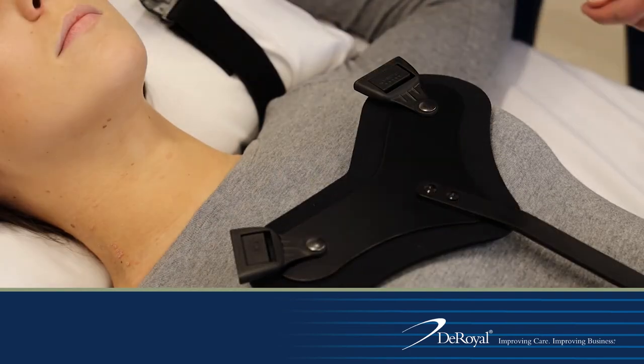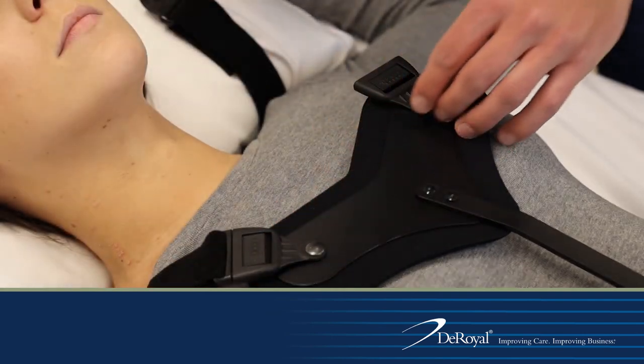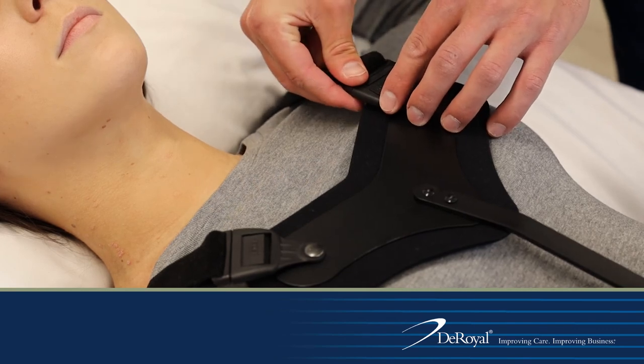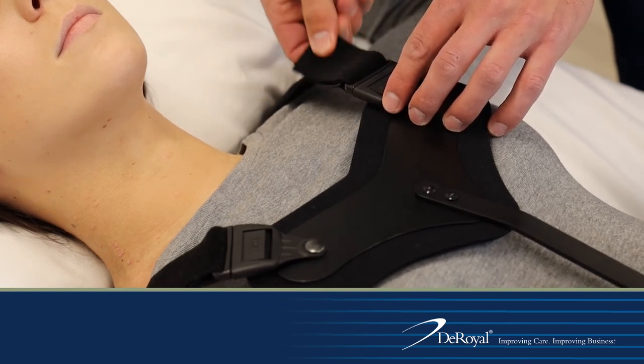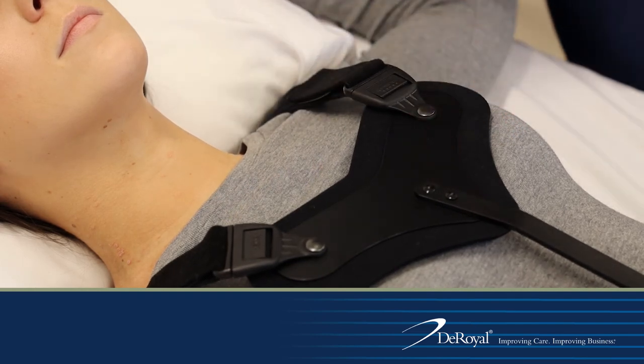Retrieve the SPK straps and clip into the sternal pad. Straps can be placed above or below the shoulders. Tighten the straps by removing the hook strip, pulling tighter, and re-securing the hook strip to the strap. Straps can be trimmed to ensure a more appropriate and customized fit.